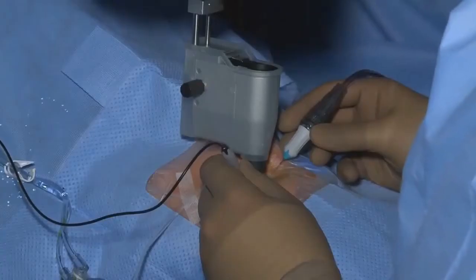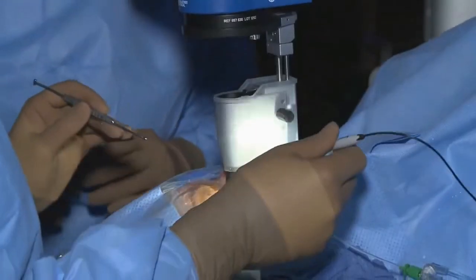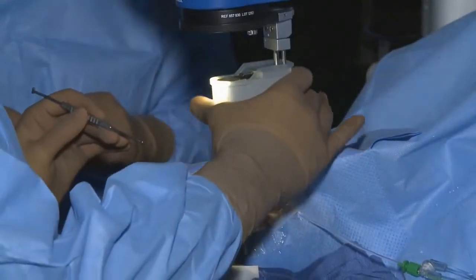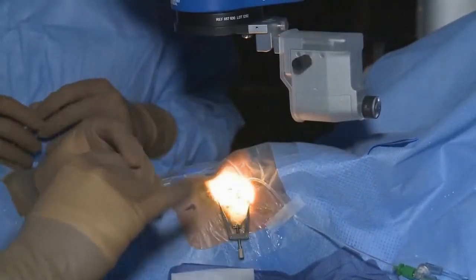When wide-angle viewing is required, the system is vertically positioned over the eye. For direct fundus viewing, it beautifully rotates out of the way.